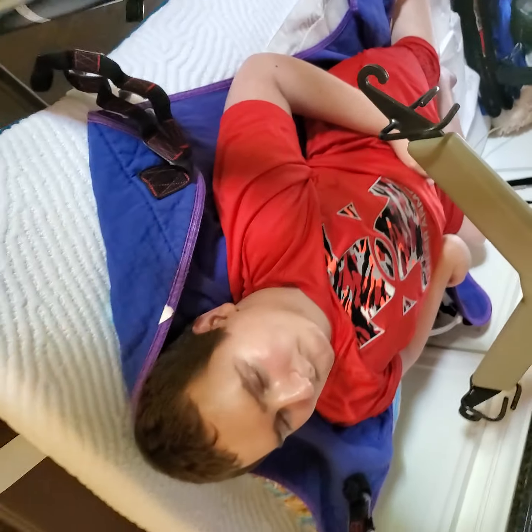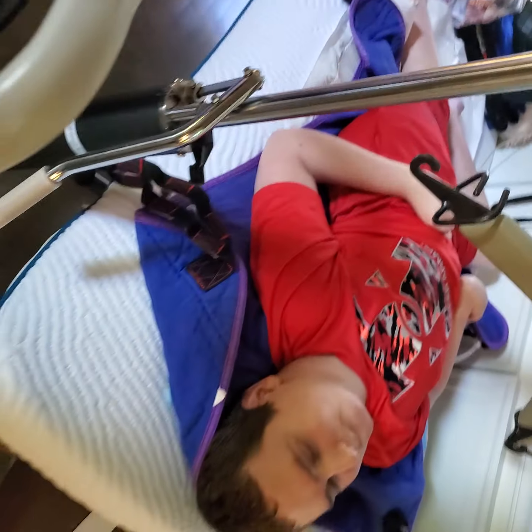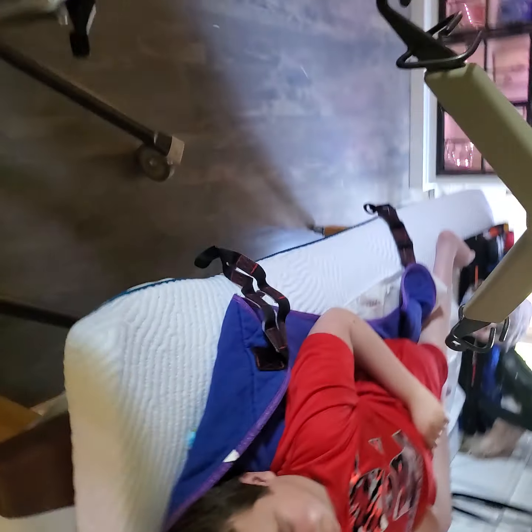Okay, and then what you can do is lift the Hoyer up a little bit by pumping it up, and then you pull the Hoyer away. And then what I normally do is put some blankets underneath his legs to support them, and we are done.